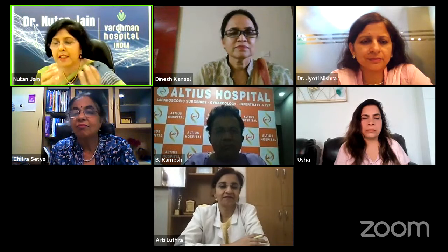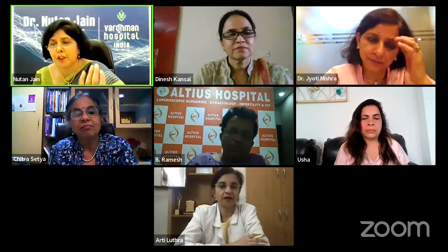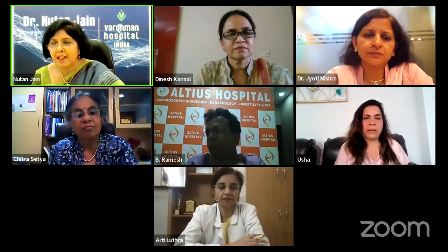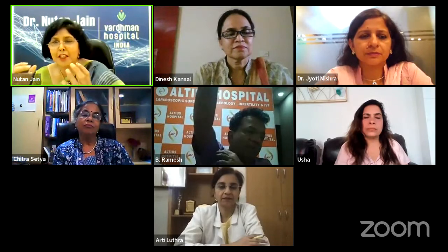What we are doing is adequate bowel preparation, adequate visualization protocols for the ureter, either stents or ICG, and a good uterine manipulator. And a relentless effort and passion to develop something new, something better, so that the existing problems can be tided over.